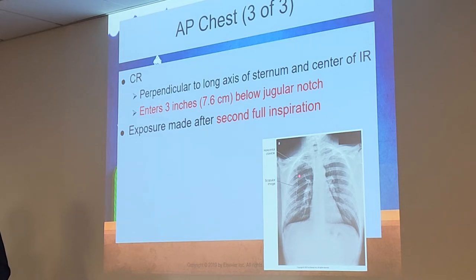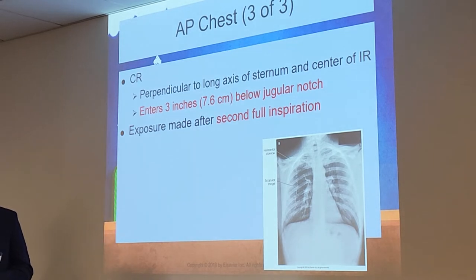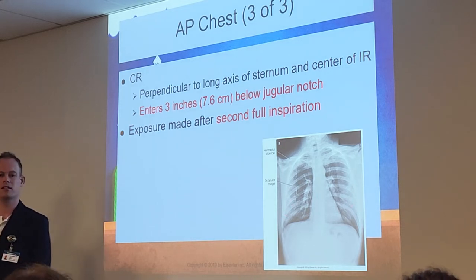Just showing you how they still move their scapula out of the lung field as much as possible, but not totally out. The little dotted lines there. That patient has slight pneumonia right there, in both sides.